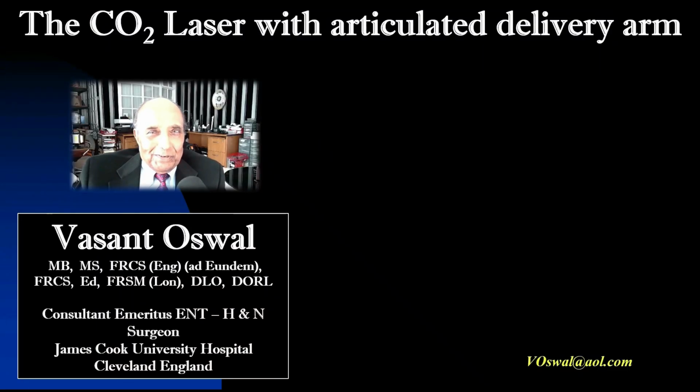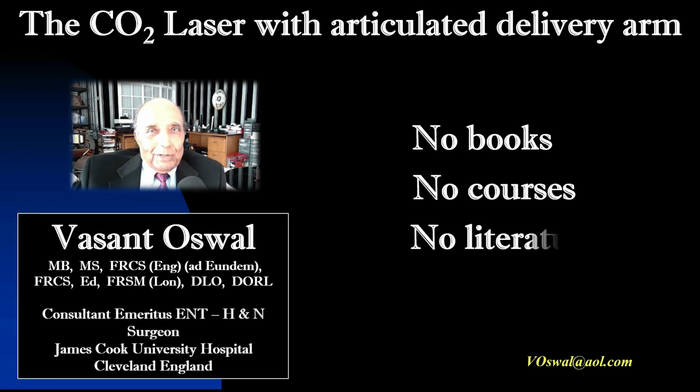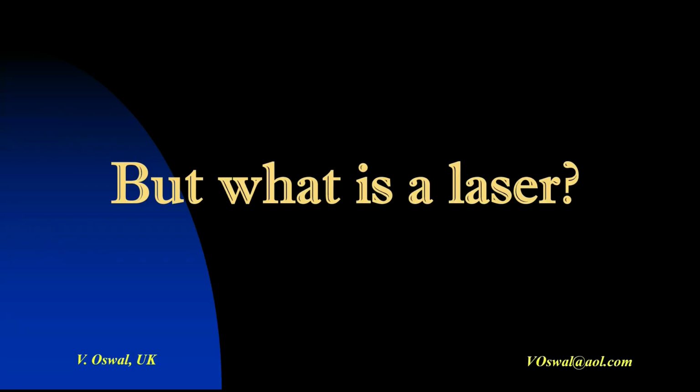It was easy to get the machine, money as well. But what to do with the laser? There were no books, no courses, no literature. So I had to teach myself how to use the laser.